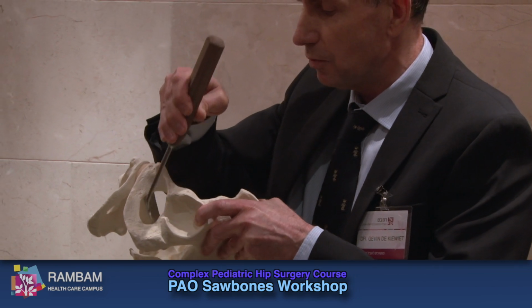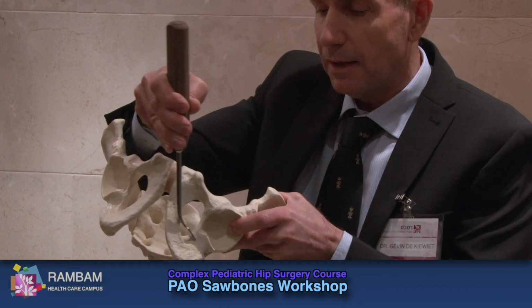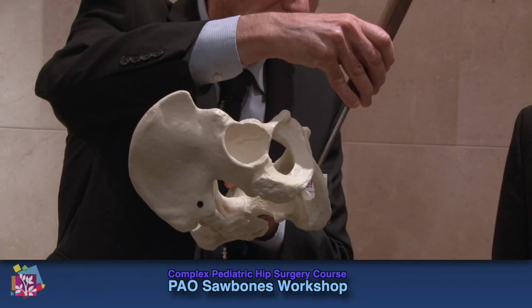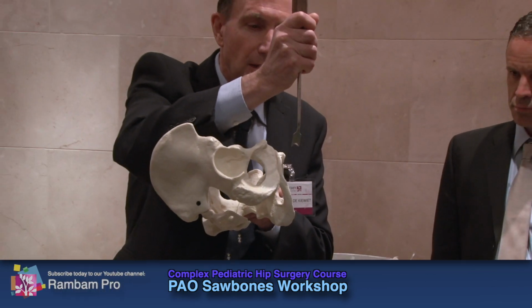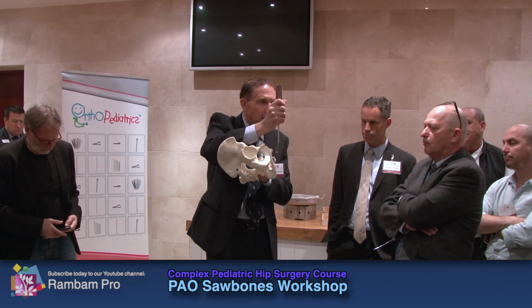I sit between the two. And I hook it on there, and I start my osteotomy there. And I check that I'm going in the right direction towards the spine. I do about 10-15 millimeters this way. I bring it back out, wiggle it back out, stay in the gap, turn it slightly towards the outside, go in again. Slightly towards the outside, go in again.